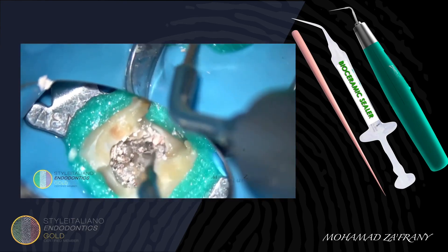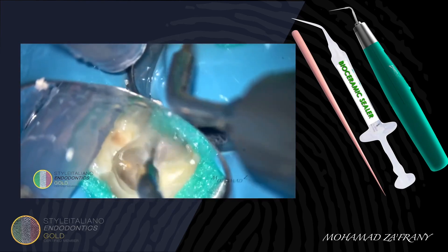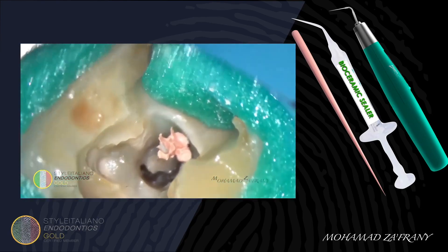Using ultrasonics, while coolant is on, I'm cleaning the pulp chamber. Here you can see the C-shaped configuration clearly.